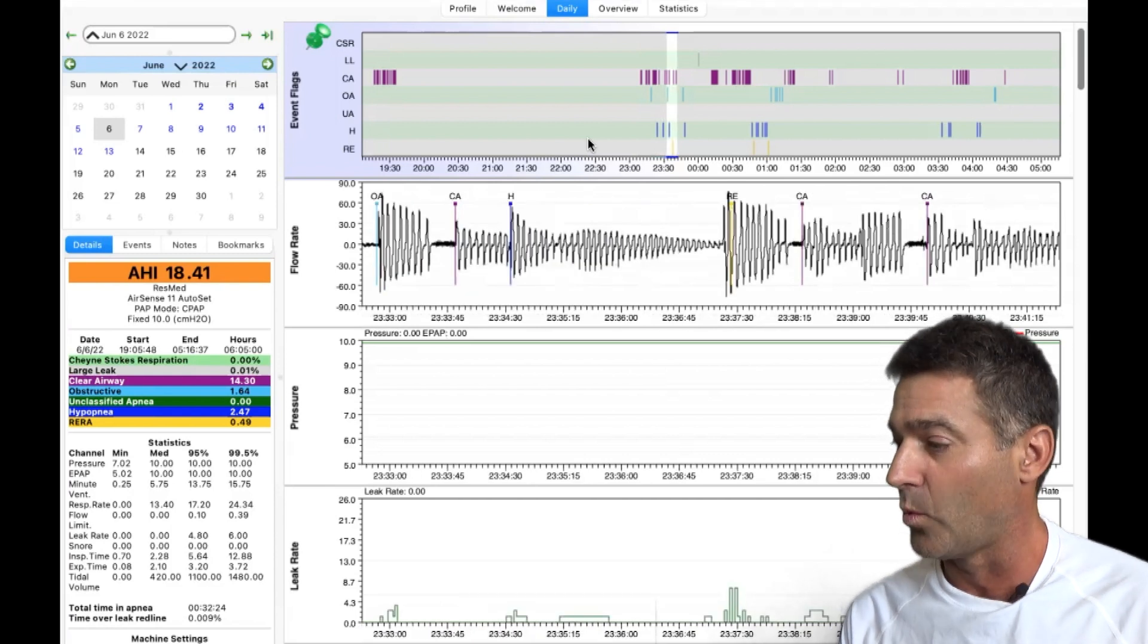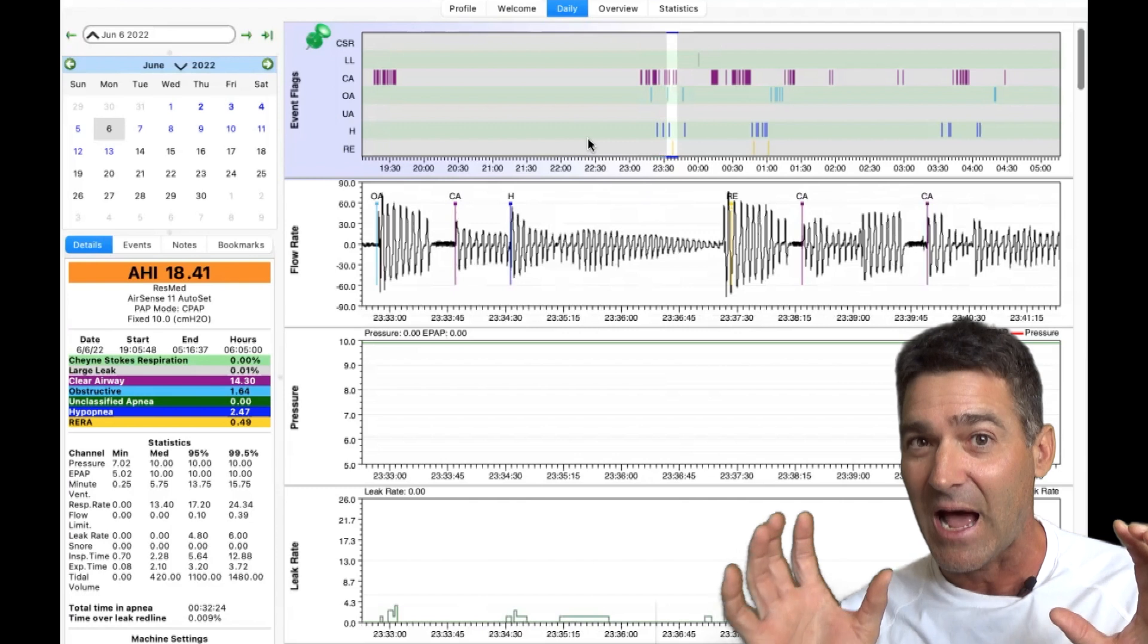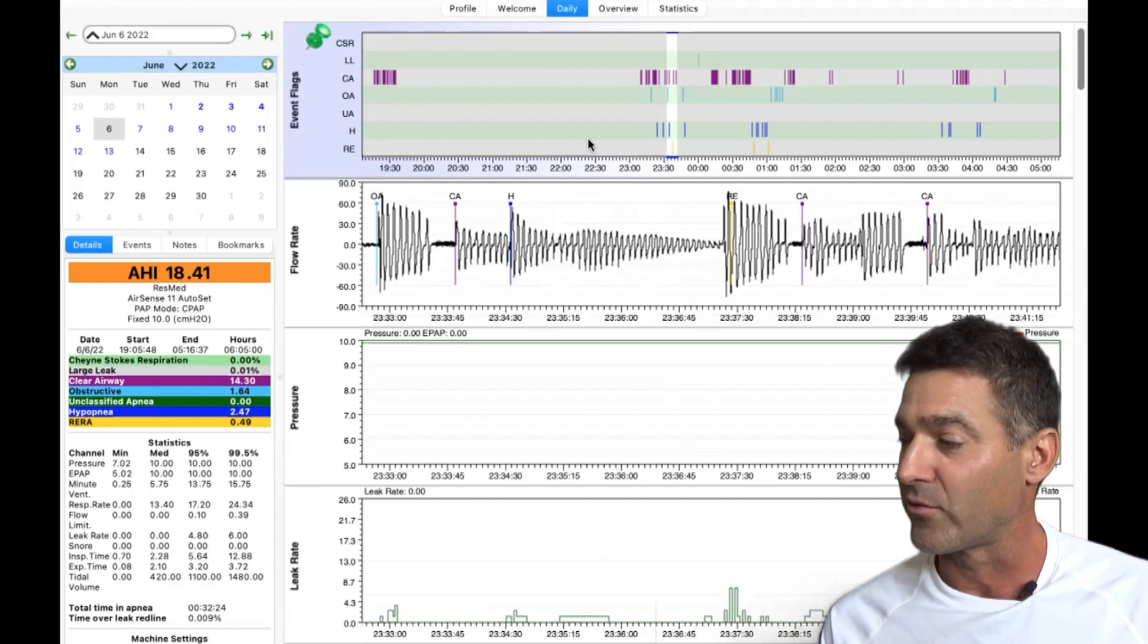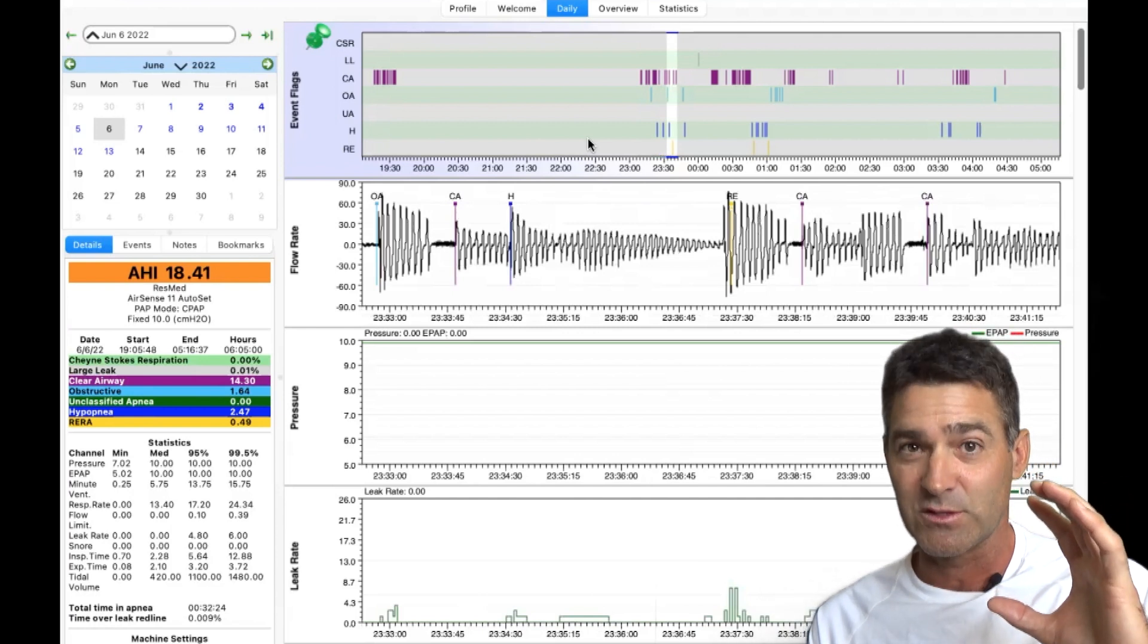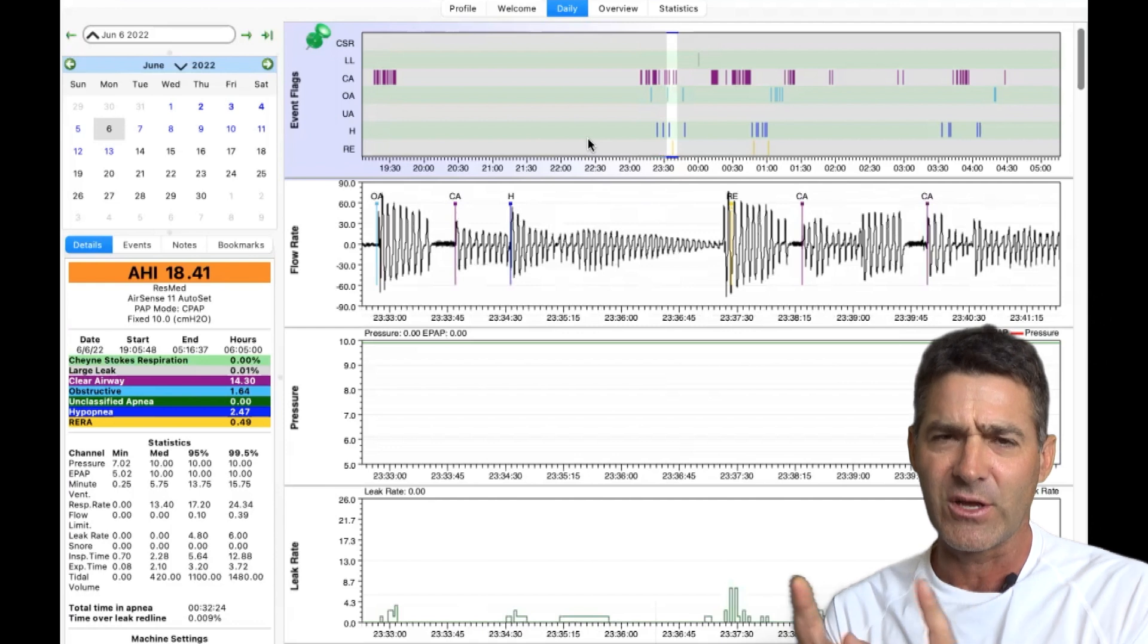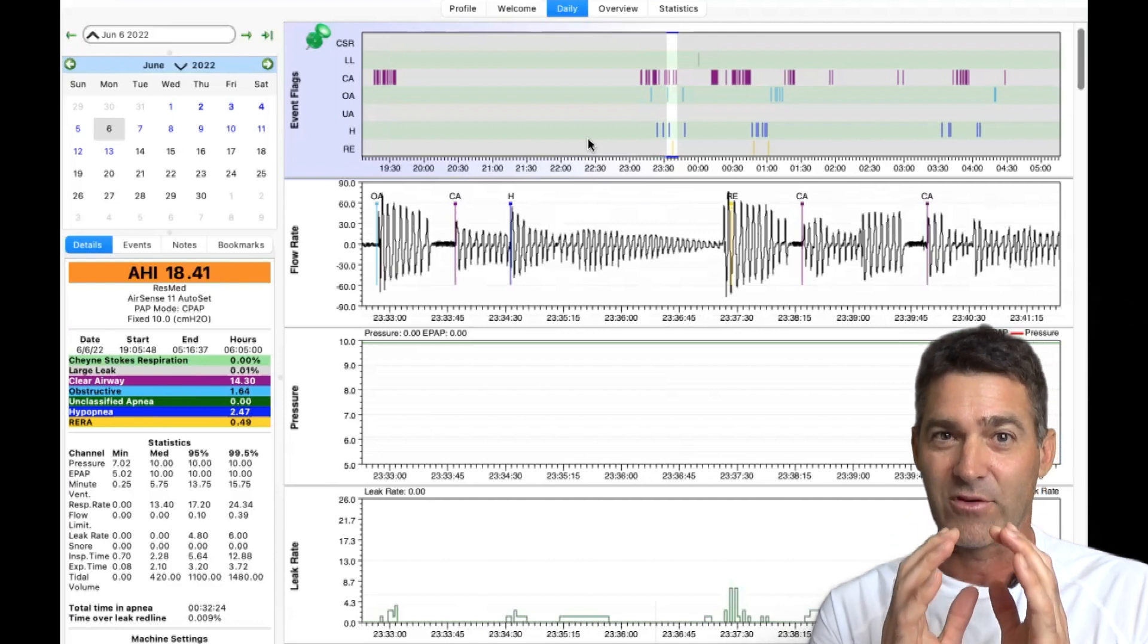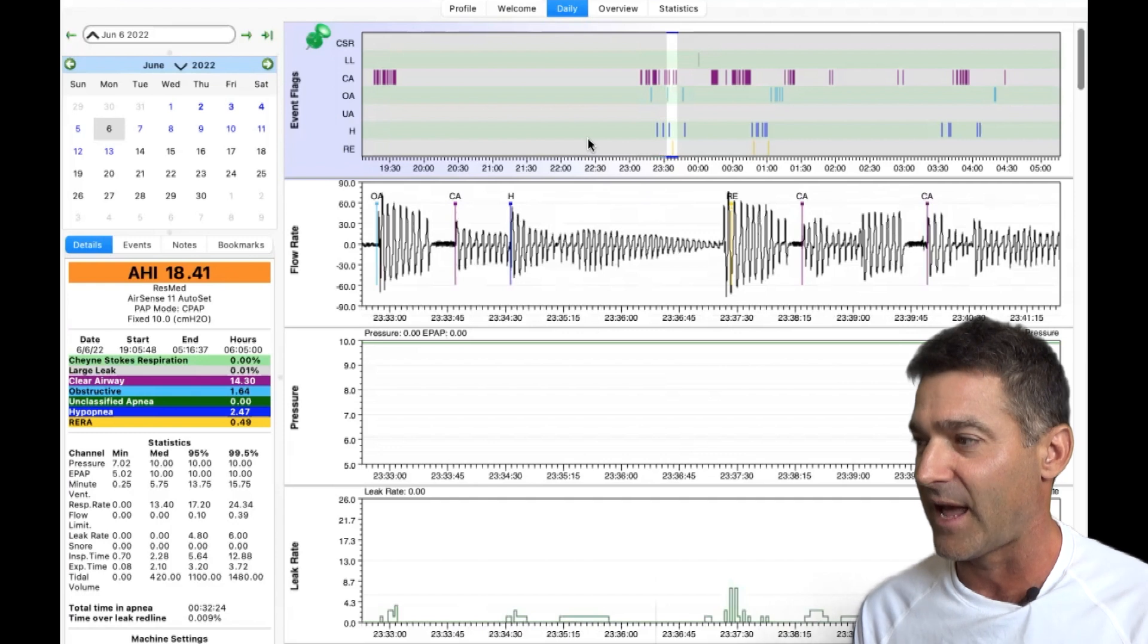What we have here though is a difficulty with what you would call overlap or complex sleep apnea. He's having central apneas at this at the same time on the same pressure. He's having obstructive events like this obstructive hypopnea. He has other things in there such as respiratory effort related arousals. So that puts you in a funny position. Usually as you increase the pressure, obstructive events will go away. Then you have a little window here of good breathing and usually that equates to good sleeping. If you continue going higher you have central apneas. He has this spot here where his obstructive apneas and his central apneas meet in the middle and you're having them at the same pressure. So that's a little bit tricky.